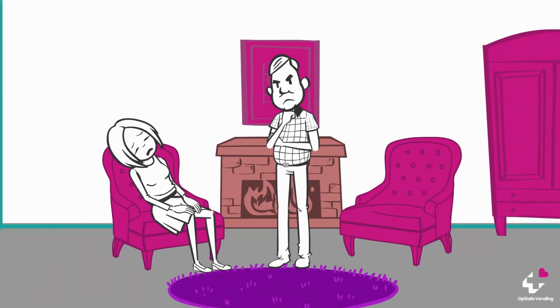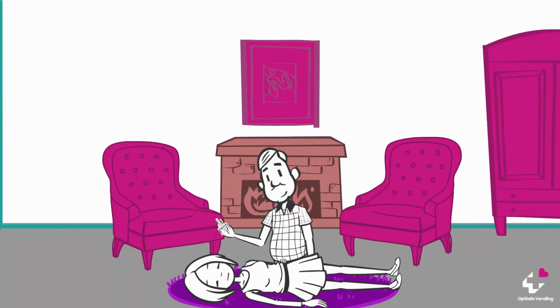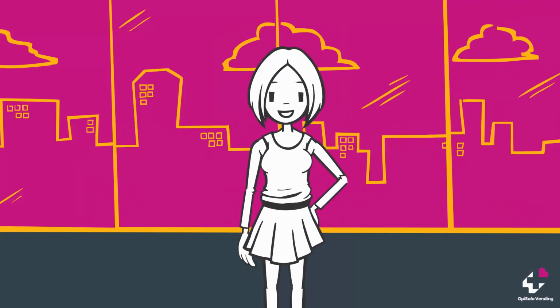There are no severe consequences if it's given to someone who hasn't taken opioids. Understanding how to recognize an opioid overdose and administer Narcan nasal spray is essential knowledge in today's world. Remember, your quick response can save a life.